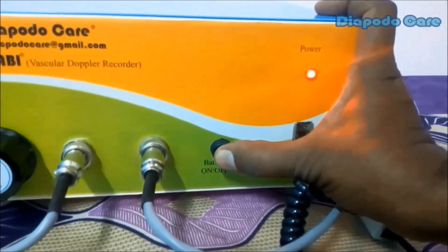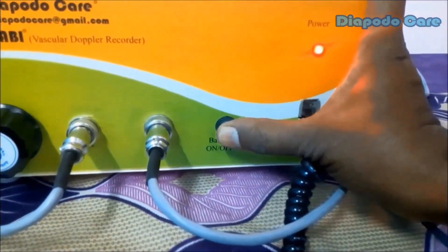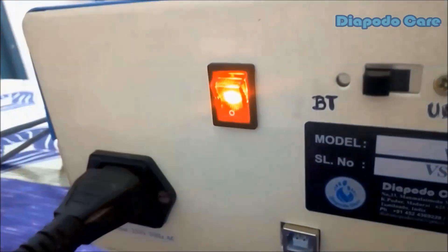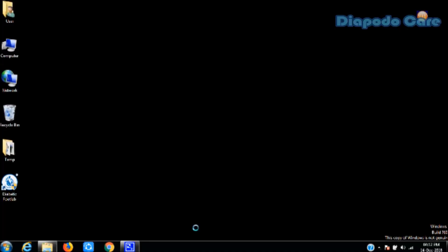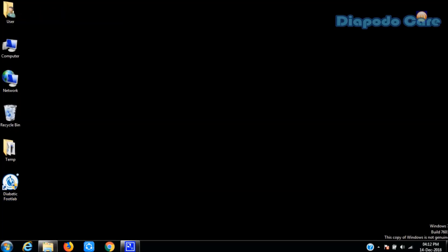The Vassabi Doppler can be operated on battery power. Using the battery on/off switch, you can toggle between main power and battery power. Before starting to work with Vassabi Doppler, we need to save some one-time settings in the PC software from the settings panel. We provide all-in-one unified software for diabetic patient foot lab screening devices manufactured by DiapodaCare.